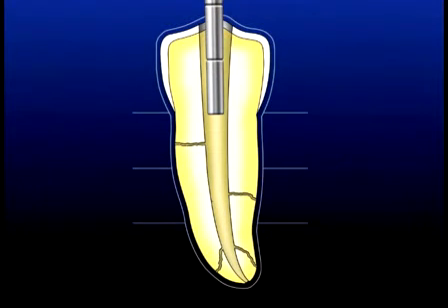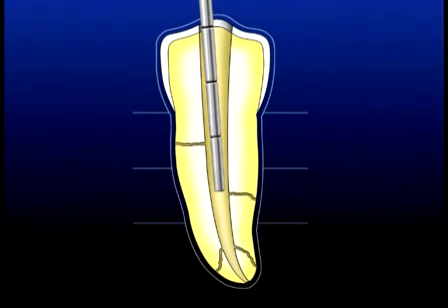Generally, 3 pluggers are used for any one root canal preparation, selecting pluggers whose diameters are just slightly less than the canal preparation at any given level. A largest diameter plugger must work passively, unimpeded by dentinal walls over a range of a few millimeters in the coronal 1/3. A smaller diameter plugger is chosen that can work passively but effectively in the middle 1/3. And a smallest plugger is selected that can work easily to within 4 to 5 millimeters from the canal terminus. The pluggers selected must be pre-fit prior to packing so that the clinician knows with confidence that when a plugger meets resistance, it is on thermal-softened gutta percha and not on unyielding dentinal walls.